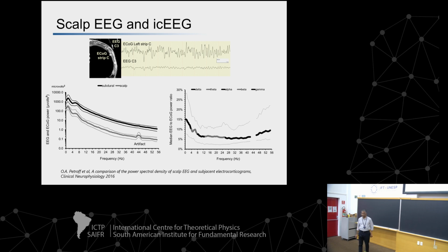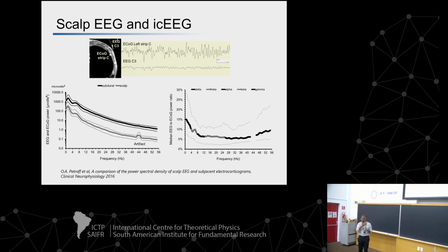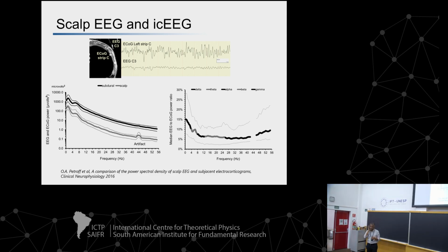Right. So that's great. On the scalp EEG, you make a good point. You can get artifacts. The artifacts are from electrical generators like muscle, eye, tongue. Like a blink artifact, you can see it go across the scalp. It'll be largest in frontal electrodes, and then it decreases as you go back. It can be much larger than the brain signal. The muscle artifacts can be larger as well, depending on which muscles are being activated during chewing. These are pretty large electrical activities generated.